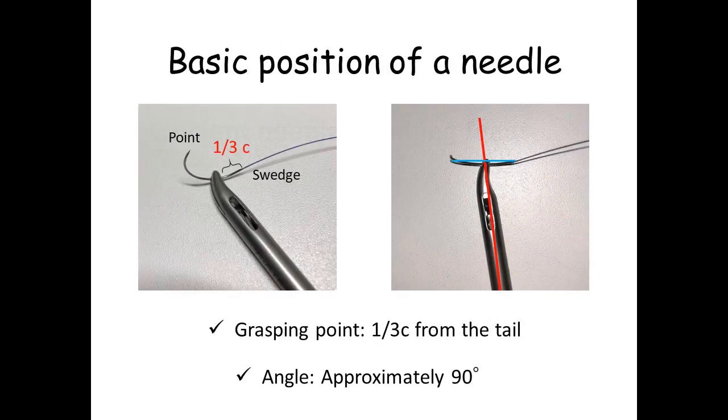This is the basic position of a needle. Grasping point is one-third circle from the tail and the angle should be approximately 90 degrees.